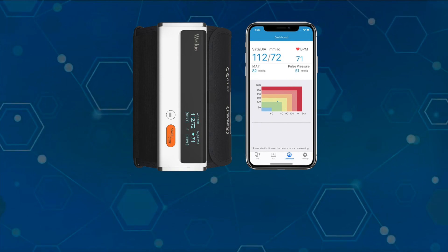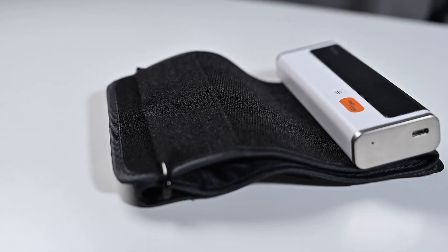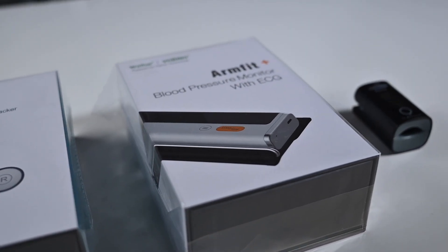As for the WellU blood pressure cuff, I'll go ahead and give this an admit as well. I think this is a totally reasonable option for a blood pressure cuff — there are a lot of brands out there, and if this fits your price point, you like the way it looks, and it folds up nice and small, this could be a great option for you. It does have Bluetooth connectivity, so you can save your results and link it with all the other devices.